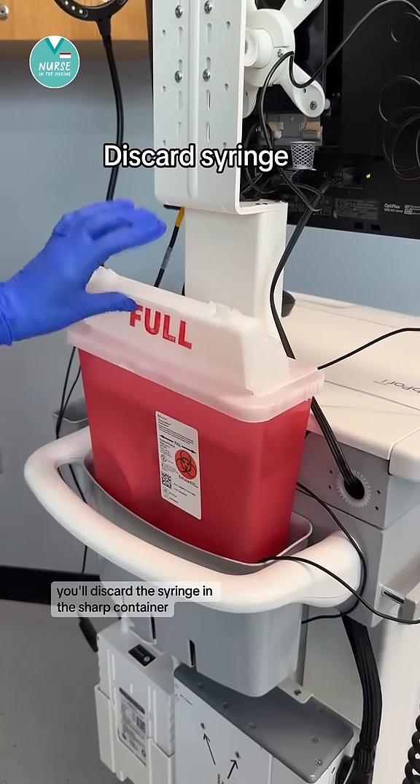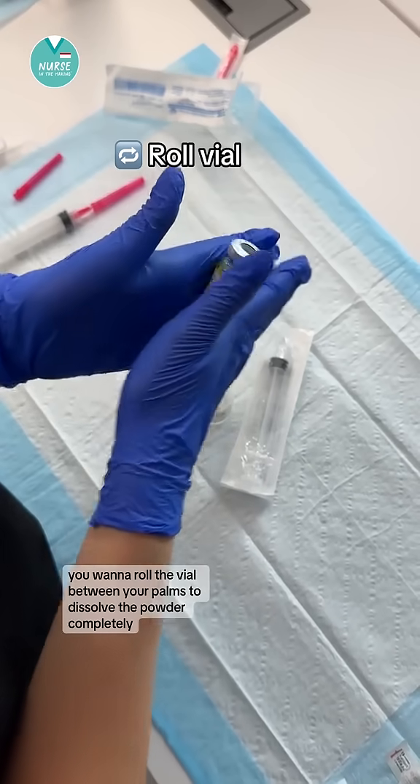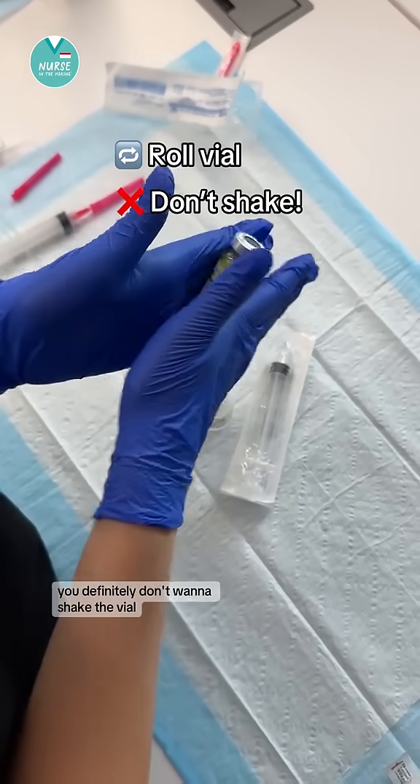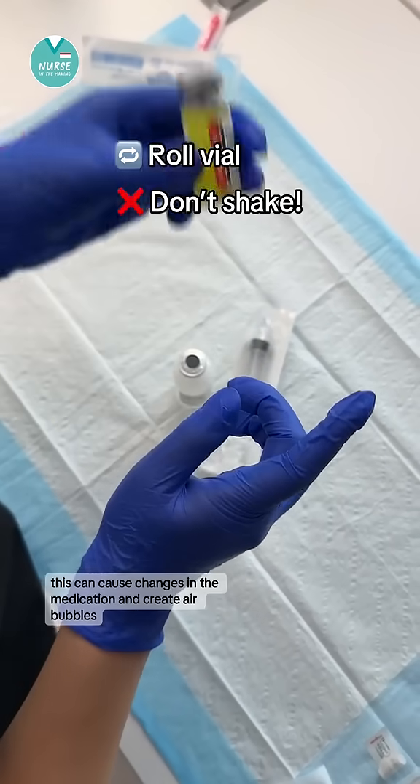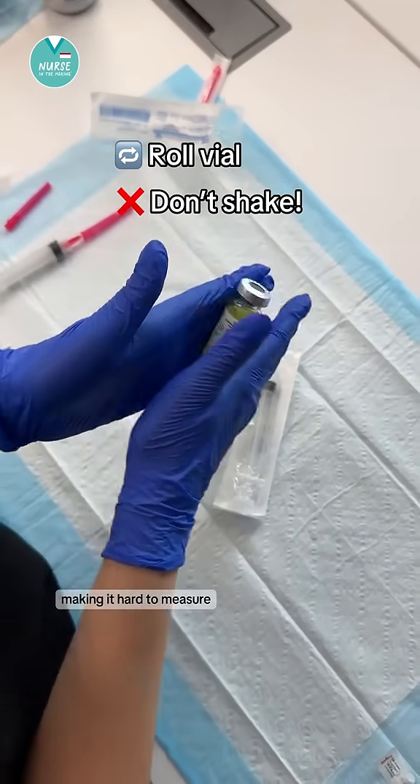You'll discard the syringe in the sharps container. You want to roll the vial between your palms to dissolve the powder completely — you definitely don't want to shake the vial. This can cause changes in the medication and create air bubbles, making it hard to measure.